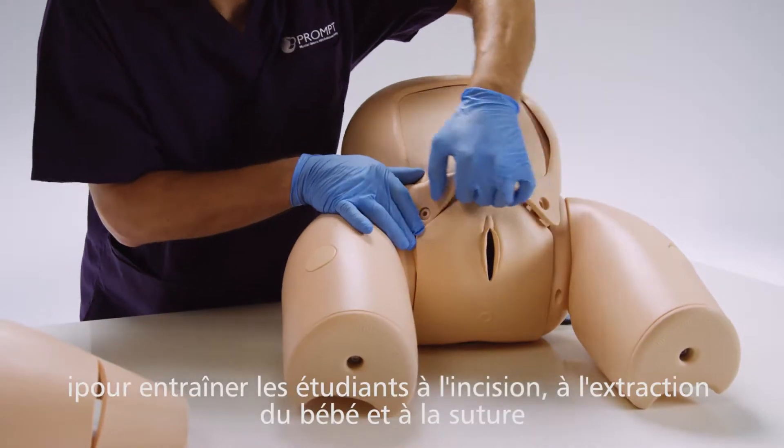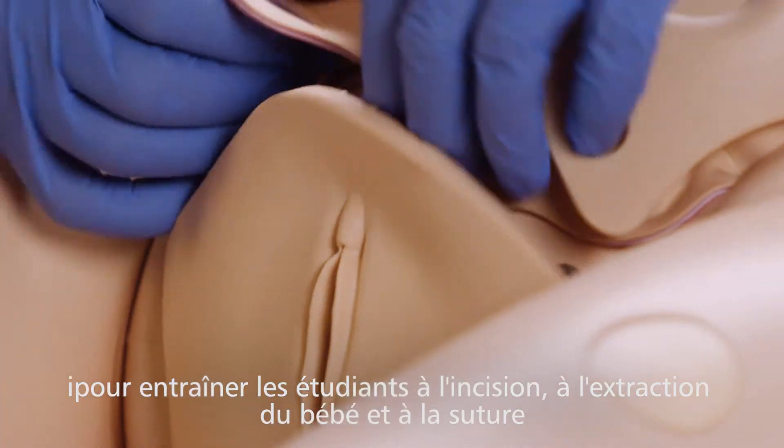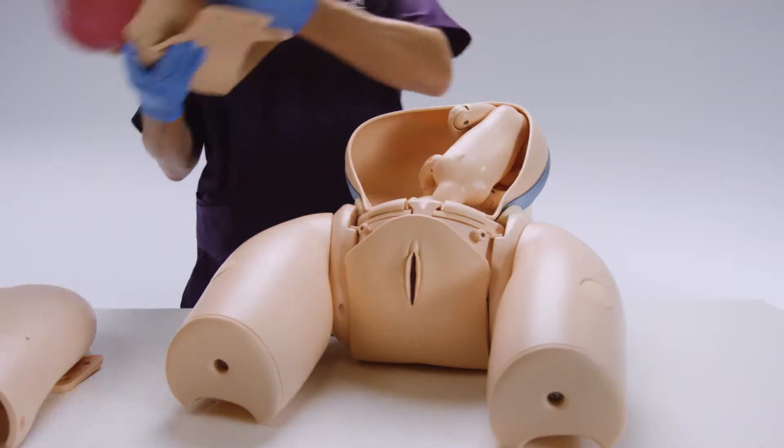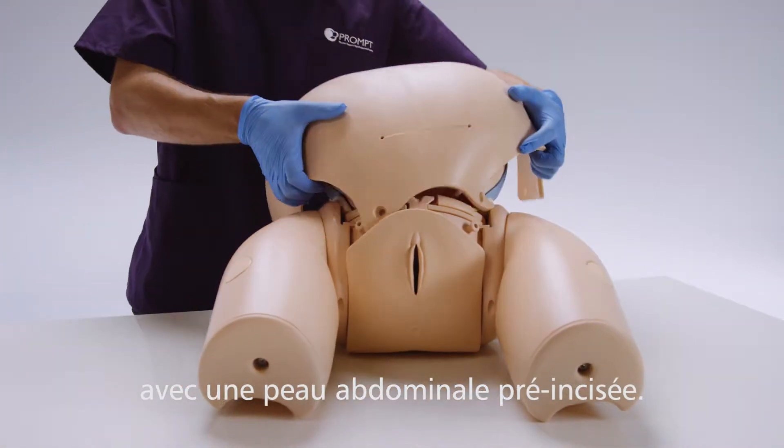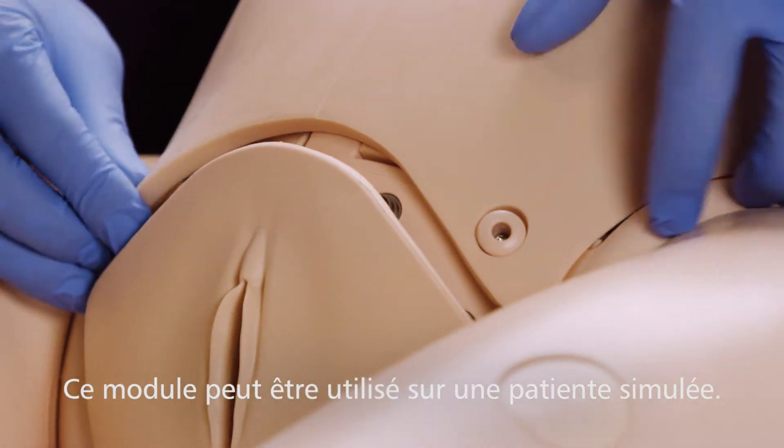The module can be used to train incision, delivery, and closure using the surgical pad, and repeated routine or difficult deliveries through the pre-incised abdominal skin, and can be set up as a simulated patient.